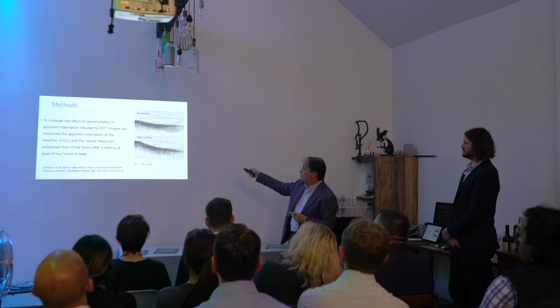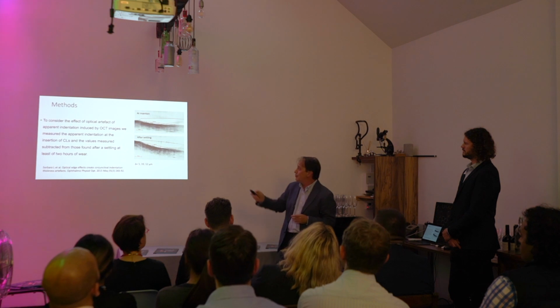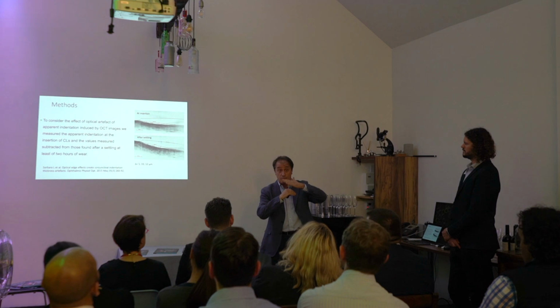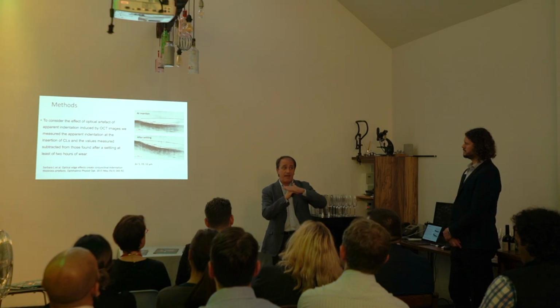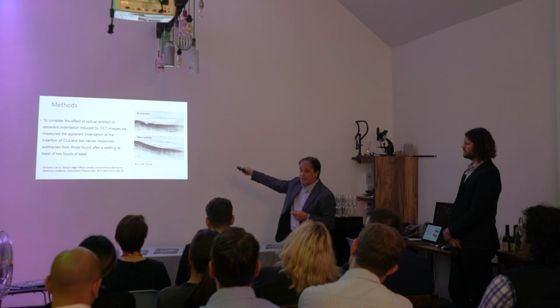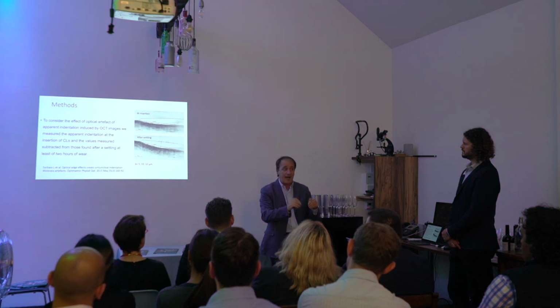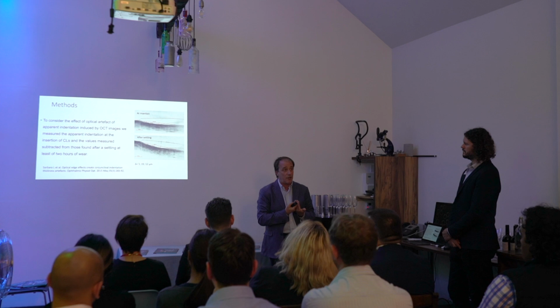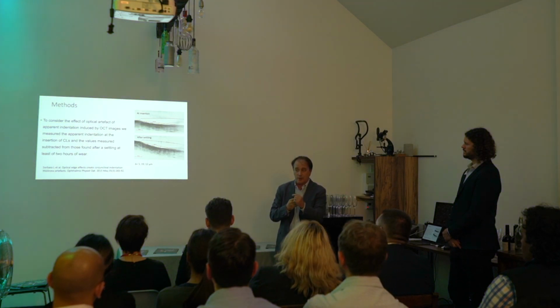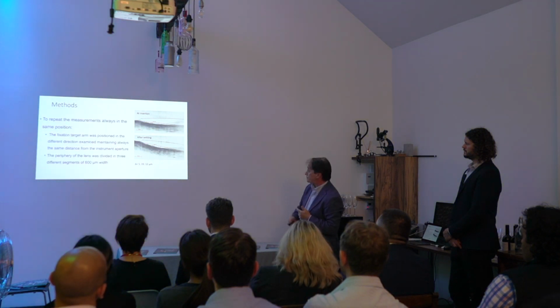The idea was to fit the lens and measure very, very fast, so the lens had no time to do some compression. In this case, I obtain this value, and I remove it from the value found on the same point after a minimum of 2 hours of lens wear. And this is a simple approach to evaluate the compression induced by the lens.